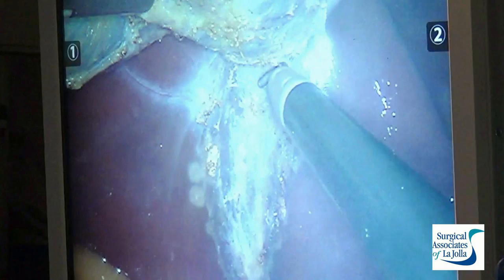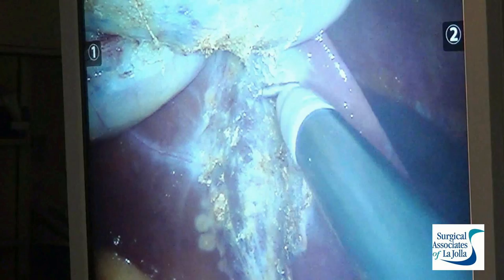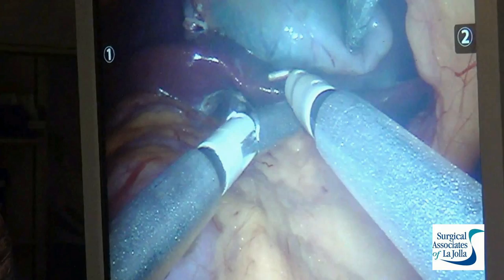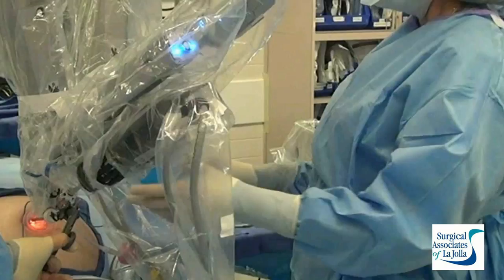Everything is done under direct vision. We never move instruments without being able to visualize them clearly. The gallbladder is going to separate here just in a moment, and then we'll look back behind. My assistant pulls the gallbladder over the liver. We look for a nice, ultra-dry liver bed, then remove our instruments and start undocking the robot, first removing the instruments and then the curved cannulae that allows me to switch my hands, enabling the procedure to be done through such a small incision.